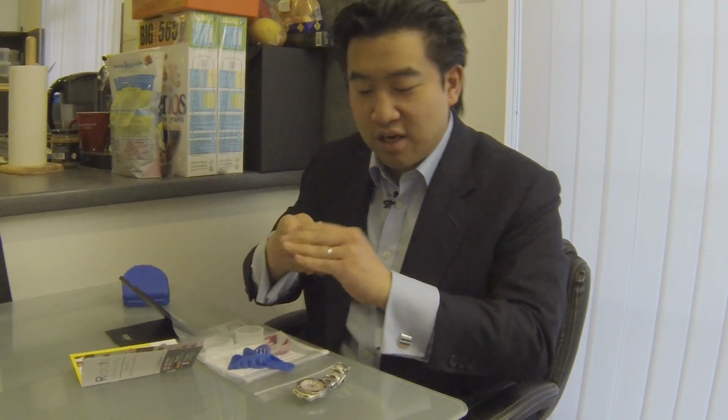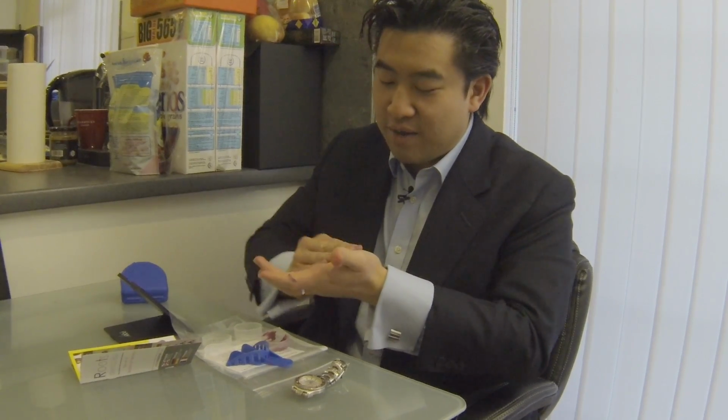It's made my hands really messy, and you just start rubbing it together with your fingers, with your palm, and you start rubbing it for 30 seconds. I've got my watch here. I started at 45 seconds, so by the 15-second mark I should start putting this in the mouth guard.